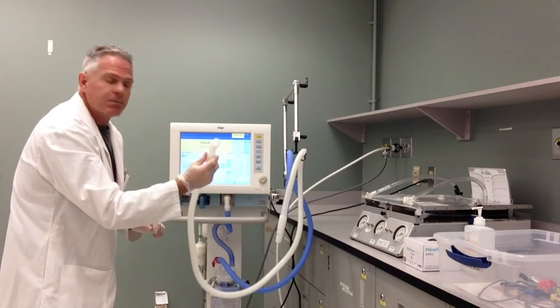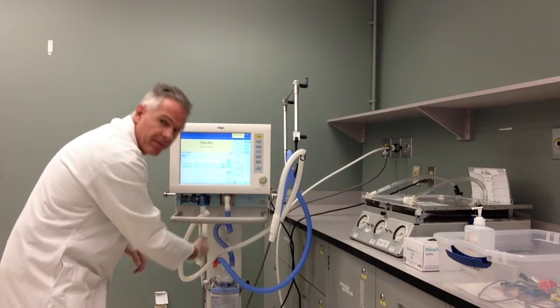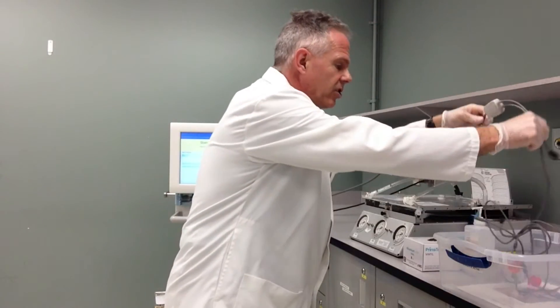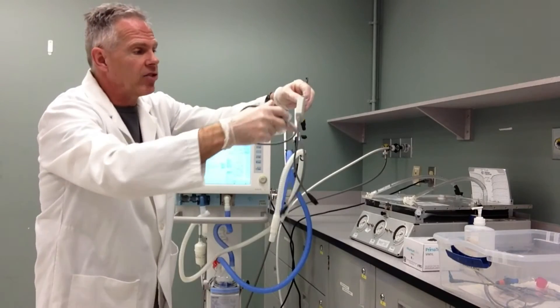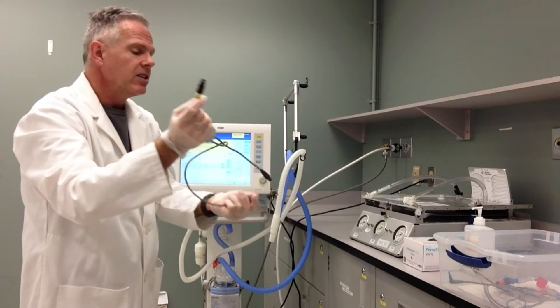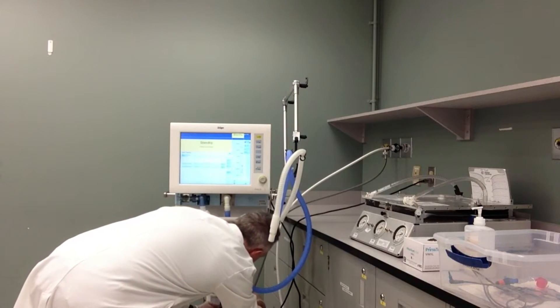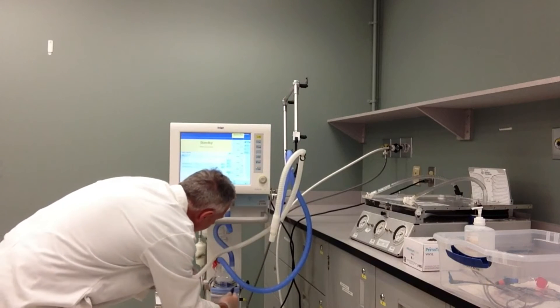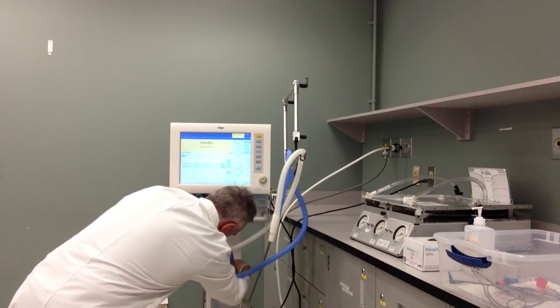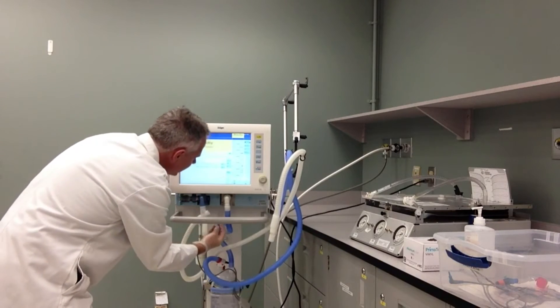The expiratory side attaches right here to the exhalation valve. Each ventilator is going to be unique. The next part of this, as it comes clean and ready for use for our patient, is the heating wires that are going to connect the humidifier to our circuit. I keep these wires clean. This plugs into the appropriate fitting at the back on the side of the humidifier. One part connects to the heated side of the circuit just at the back, and the other part connects to the exhalation part of the circuit.